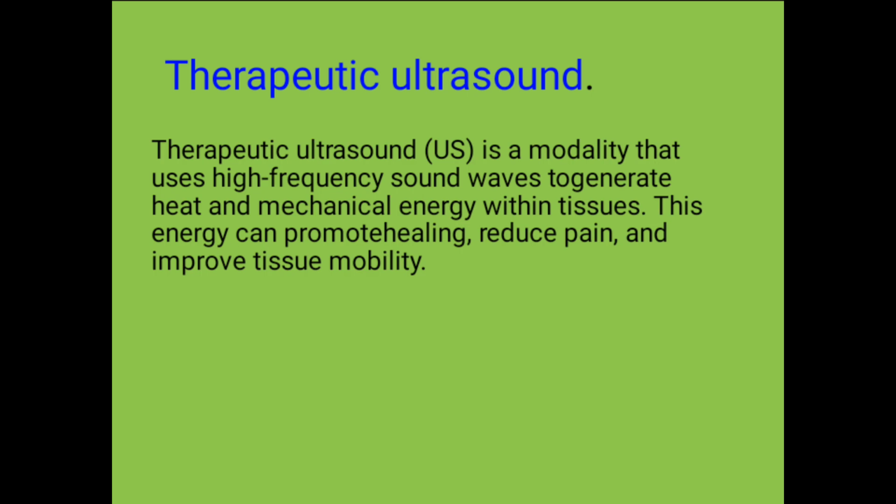And this energy which is produced can promote healing, reduce pain, and improve tissue mobility. So that is basically what a therapeutic ultrasound is.